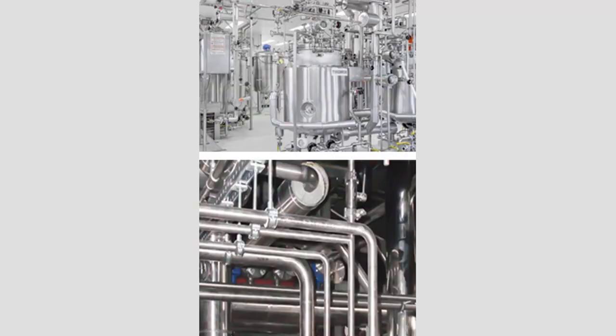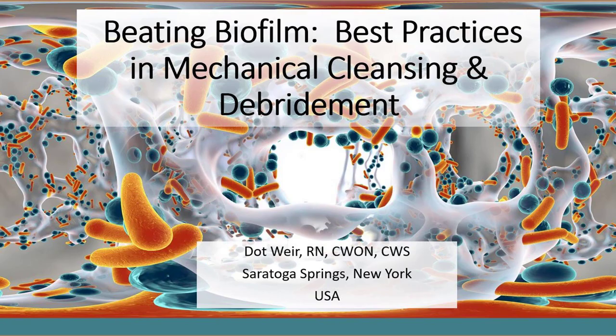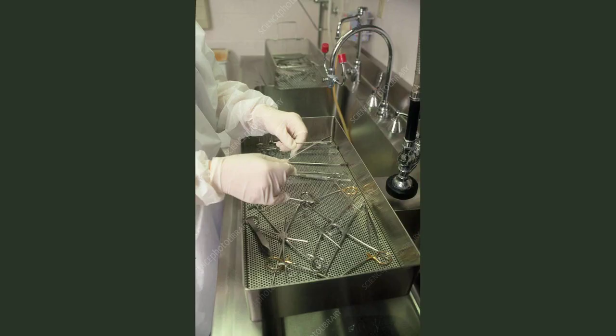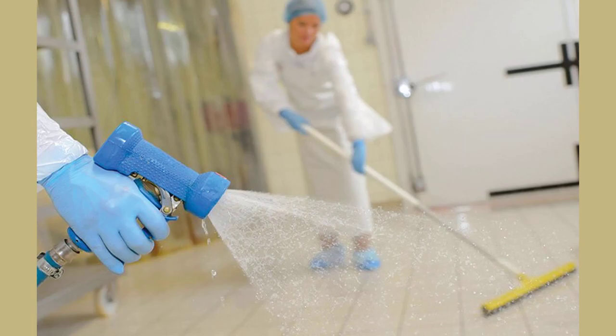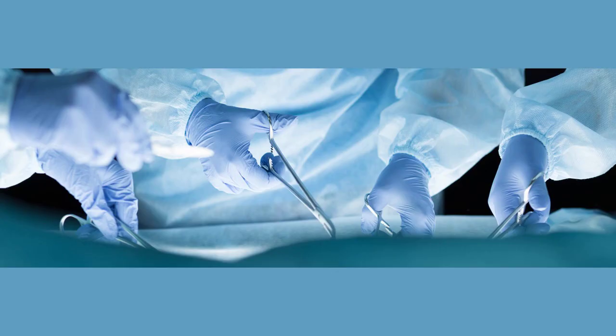Biofilm forms on surgical equipment due to improper handling, storage or cleaning. For example, you could pass microorganisms onto an instrument if you touched it with your bare hands after sanitizing it. Contaminated tap water is another common source because you must disinfect everything in a water-based chemical solution after surgery. Even simply storing a contaminated instrument too close to others can have a domino effect.